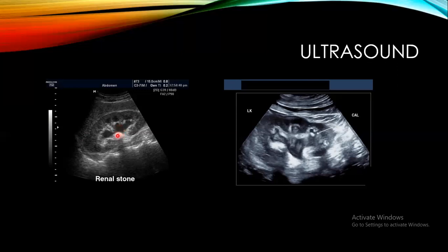من تصطدم الموجة الصوتية بالحصوة راح تصطدم اللي وراها واللي وراها. اصطدام مئات الآلاف من الموجات الصوتية خلال وقت زمني قصير، اللي هو أقل من يمكن نص دقيقة أو ربع دقيقة، راح يسوي لي ايكوجينيسيتي عالية بمنطقة الاصطدام. هاي الايكوجينيسيتي العالية راح ترتد على البروب نفسه، وراح يقرأ لي انه there is an echogenic lesion بالصورة. طبعا راح نشوفها on the screen، الصورة اللي displayed on the screen راح نشوف هذا الايكوجينيسيتي.